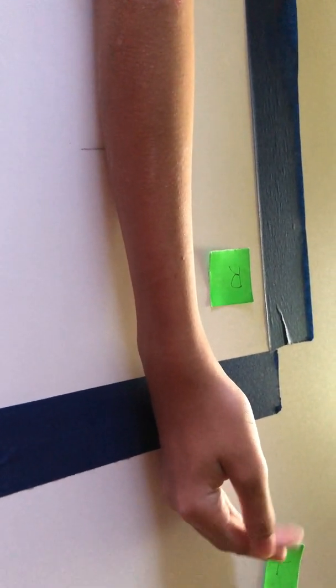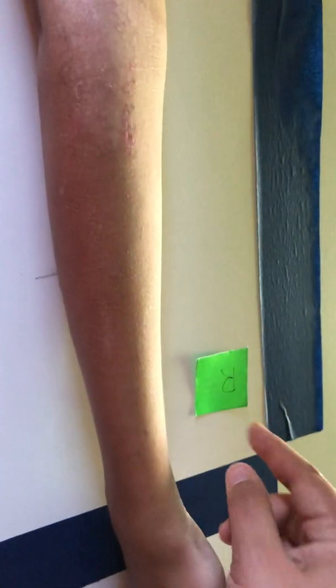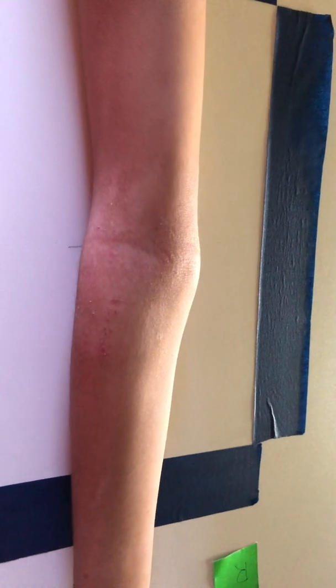And then next, we will do the AP elbow. Again, this is the right arm, so right marker. I'm going to bring this a bit more up, such as so. The film size is going to be 10 by 12, but still at 40 SID. The hand is supinated, and the central ray is directed perpendicular to the elbow joint. The anatomy I'm trying to get is the elbow joint, distal end of the humerus, and proximal end of the radius and ulna.